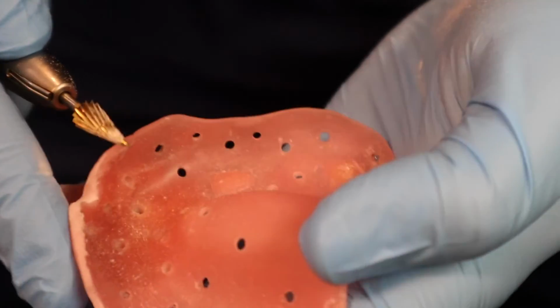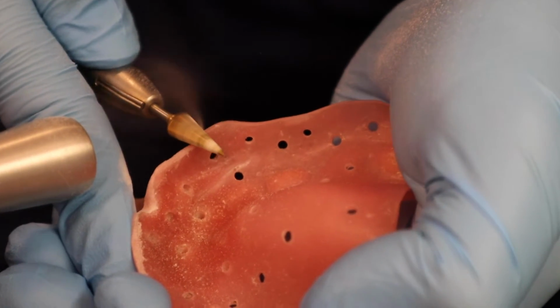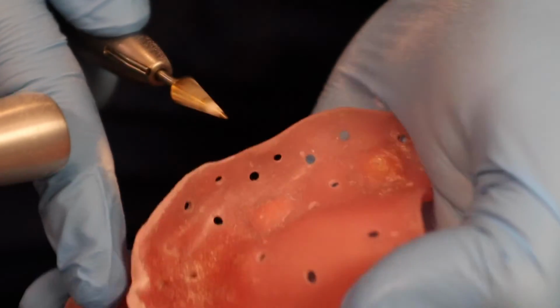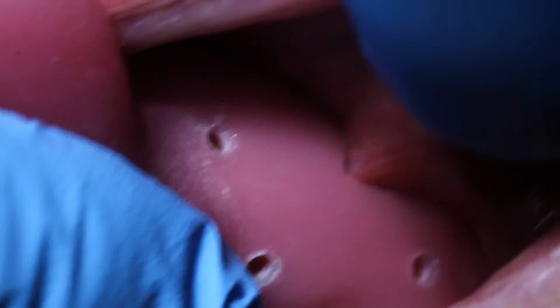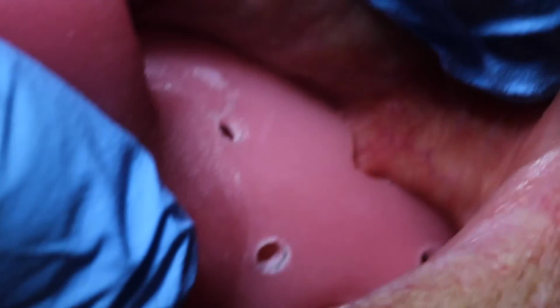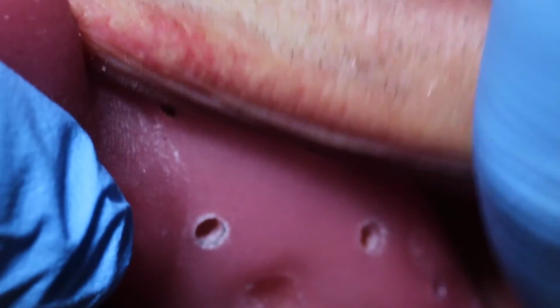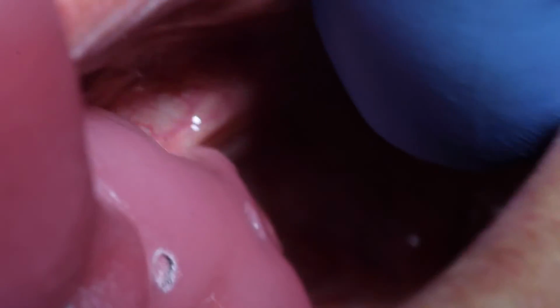I'm basically checking all the areas in the mouth where the movable tissue bumps the tray out of the way, and I'm adjusting that on the tray so that in the end none of it will be pushing the tray, right? So here it's a little bit better now, and here it's much better. So now it's not pushing my tray out of the way there. So I'm just going to talk through these different sites.